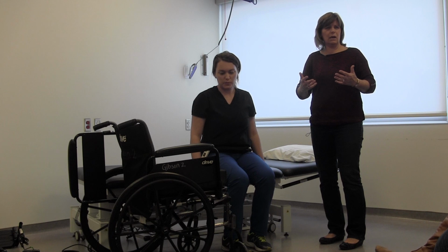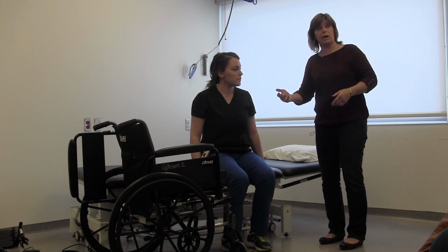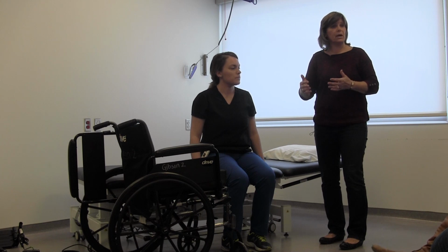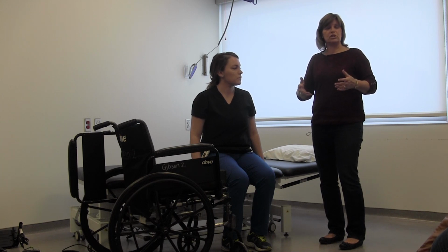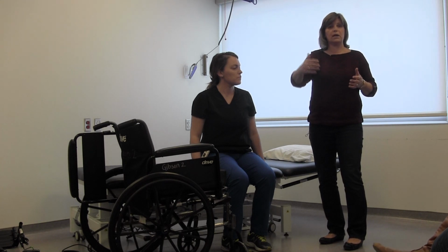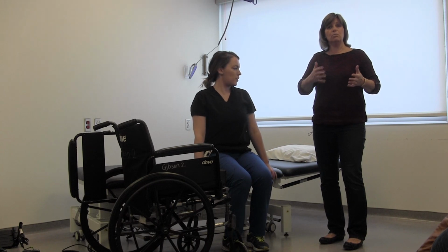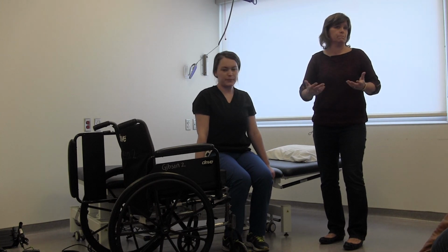You know, you think of getting in and out of a car. On the passenger side, you're getting in on the left, you're getting out on the right. So you need to be able to move in both directions. It's only under special circumstances that we set them up so that they're only going in one direction. And it could be someone who's a pusher or someone who can only move well in one direction.